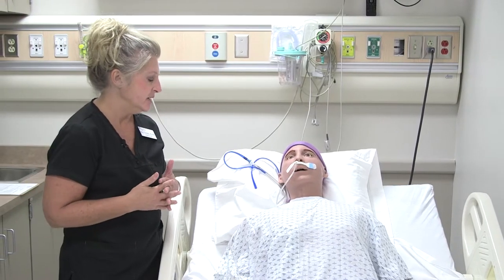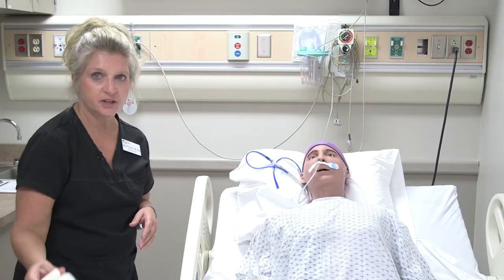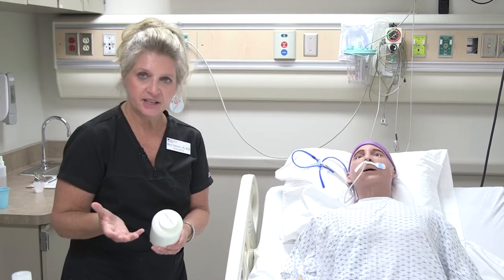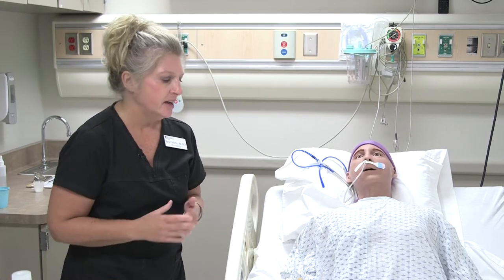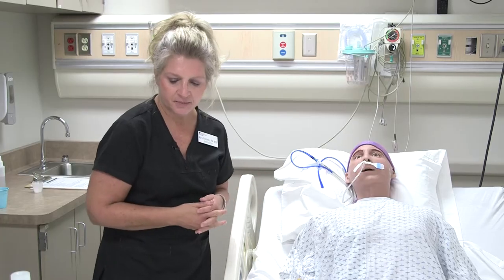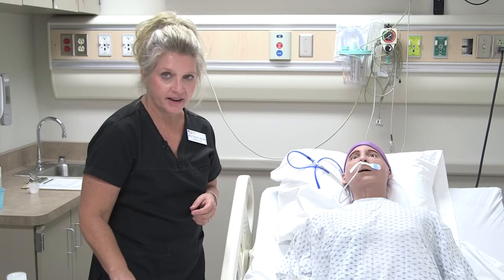When giving tube feeding through an NG tube, you want to check the provider's orders and make sure you have the correct tube feeding formula — the same as with any medication. Double-check with your MAR and do your checks. When you come into the patient's room, also verify their ID, confirm their name and date of birth, and check any allergies they might have.